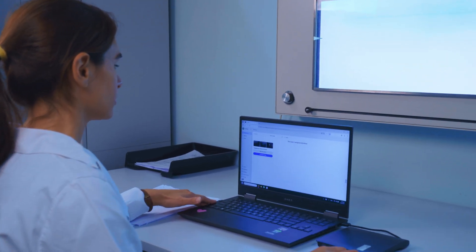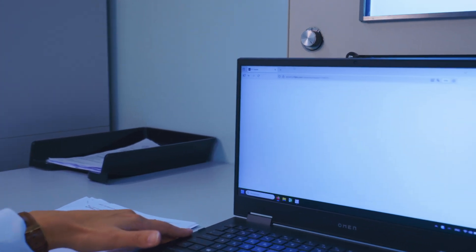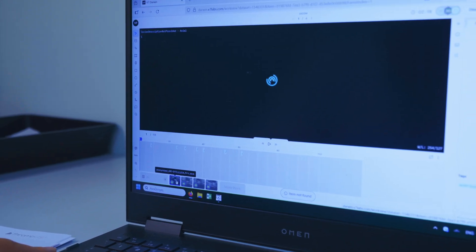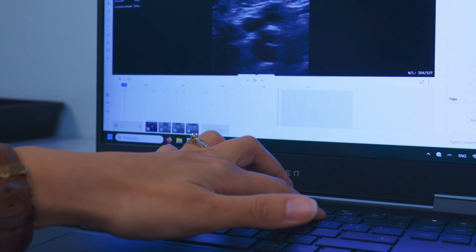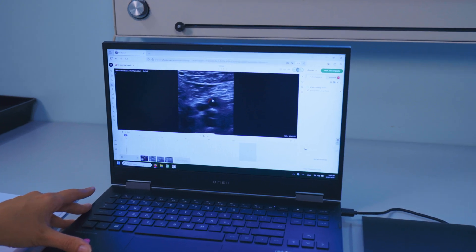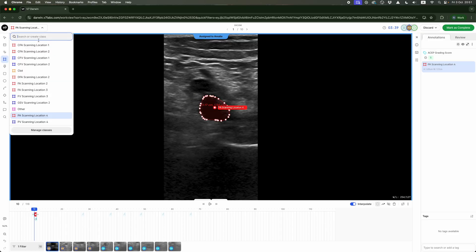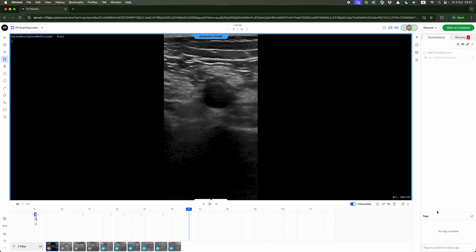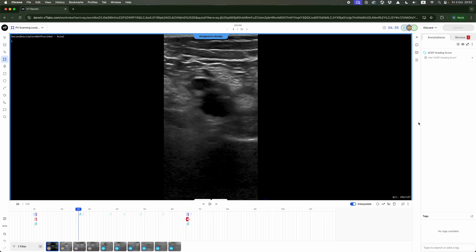The final critical step involves the data annotation platform, where the collected ultrasound images are prepared for training our artificial intelligence models. Experts meticulously label the data across four scanning levels, identifying the key anatomical structures, noting any anomalies, and grading image quality using the ACEP grading scale, to ensure consistency and comparability across all hospital datasets.